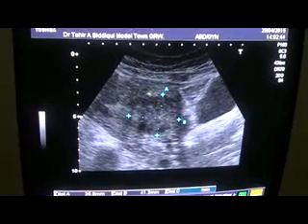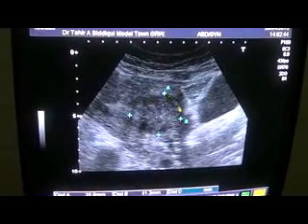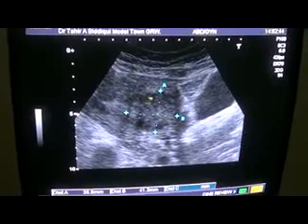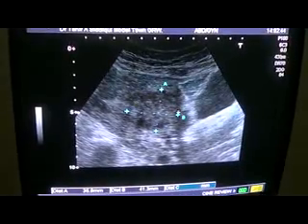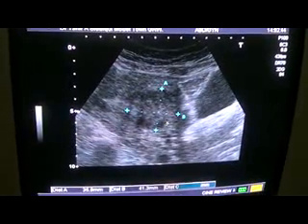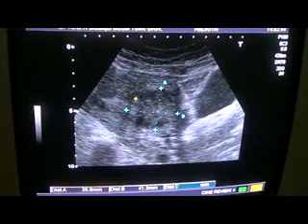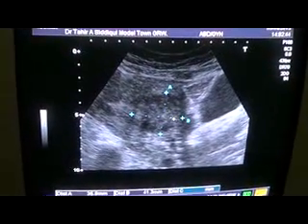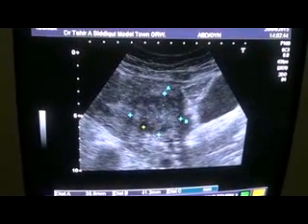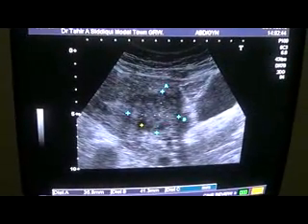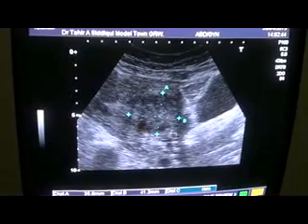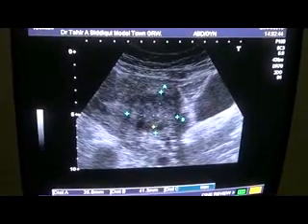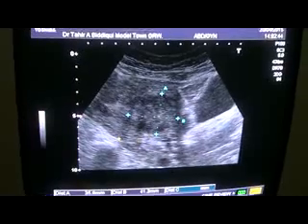This is the poorly demarcated solid mass, predominantly echogenic with a hypoechoic outer rim, with internal cystic areas which are consistent with internal necrosis.